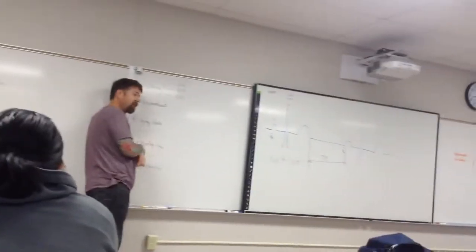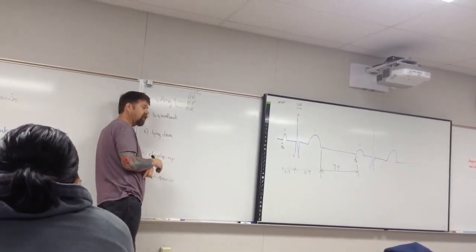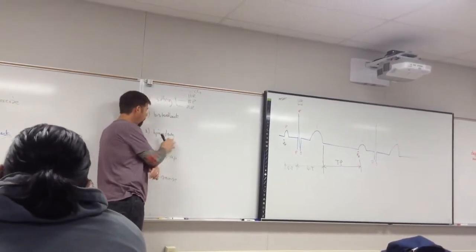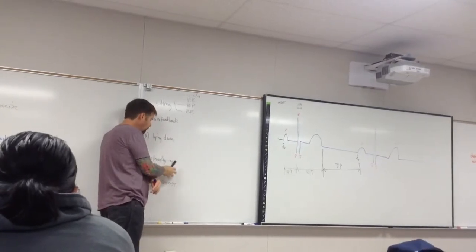Okay? And then have them lie down. And again, have them lie down for 5 minutes or so. And then don't tell them you're going to do it, but then just do the data. Collect all the data on them while they're lying down, and then write all that data down, then have them stand up.